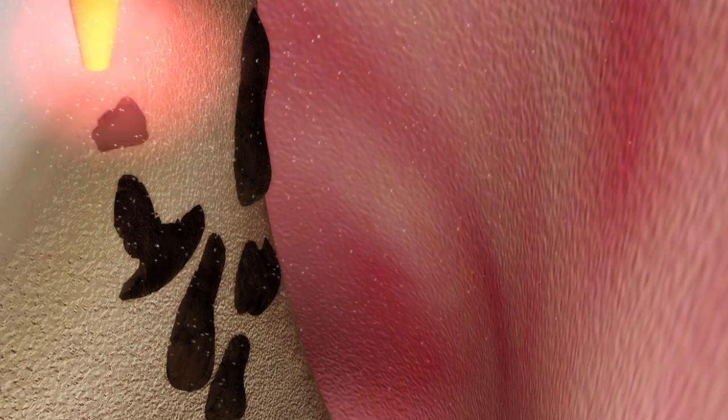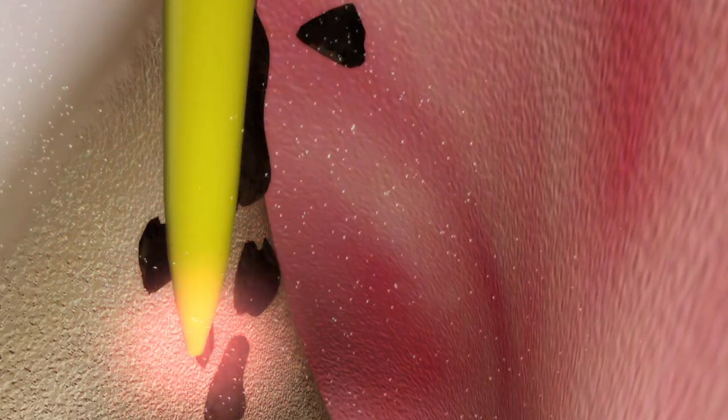With the laser firing, the tip is lowered along the root surface towards the bottom of the pocket until you feel a piece of calculus on the root surface.